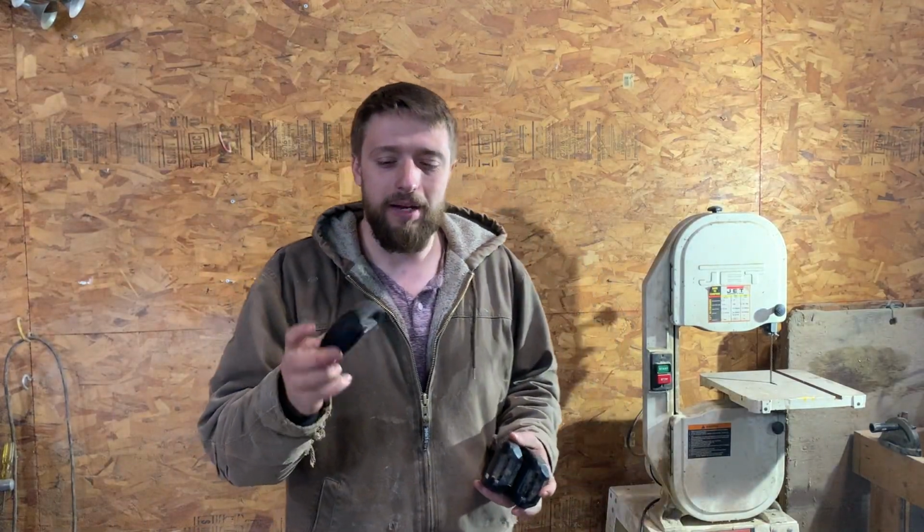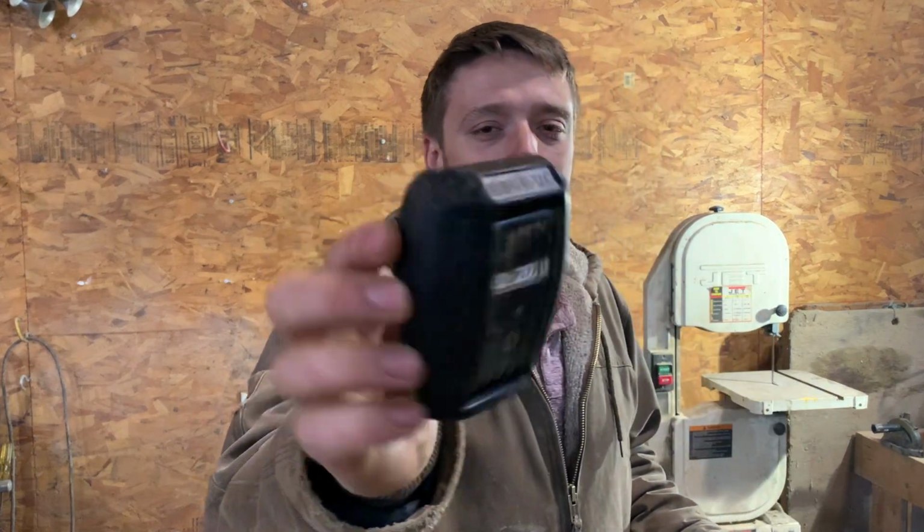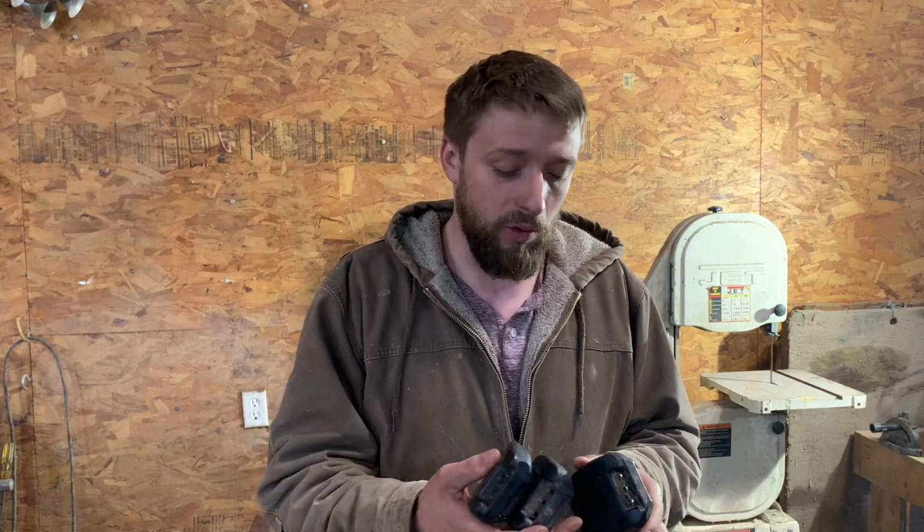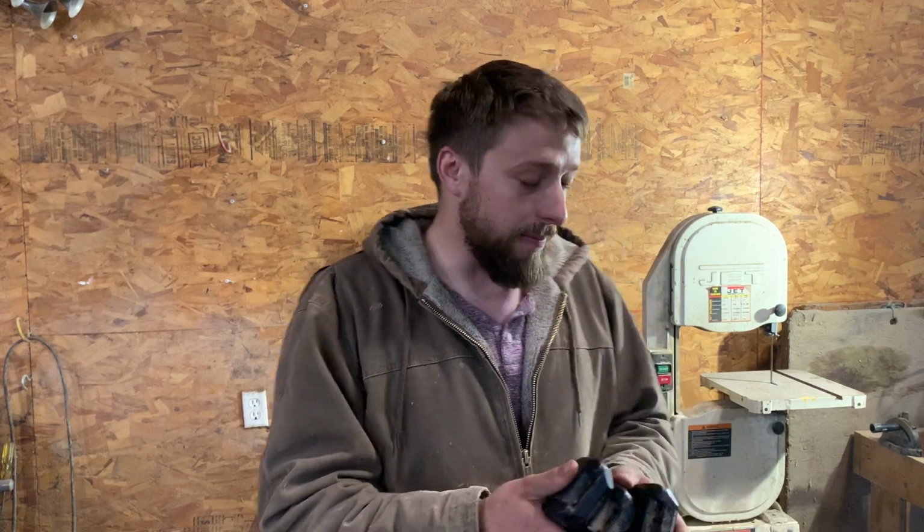Hello folks, today I'm going to show you how to rebuild and replace the batteries in these SCR HR tags. These are the rumination tags as well as the activity tags, and I'm not sure what generation they are, but I have replaced batteries in several different generations, and so far there's not a lot of difference in them. So I'm going to show you the process, what I've used over the past years, what seemed to work the best and what hasn't seemed to work, step by step.